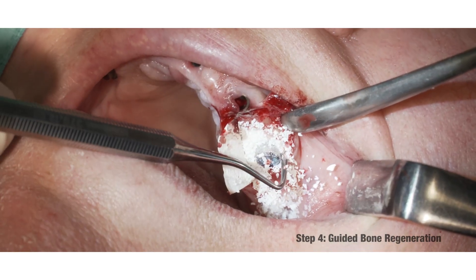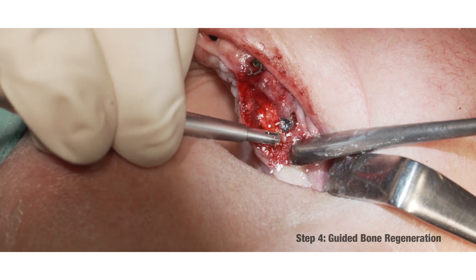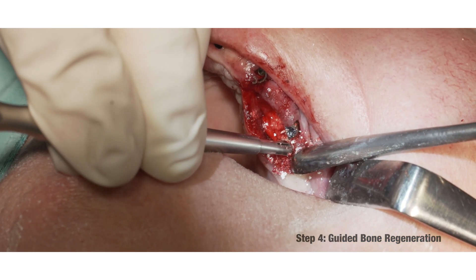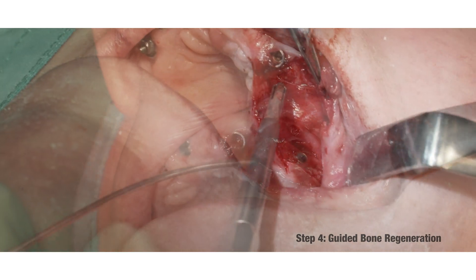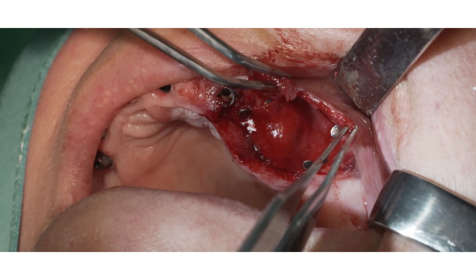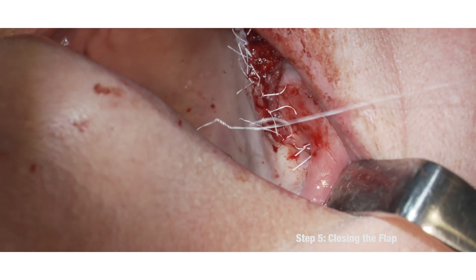Placing of a collagen membrane and filling up the bony defects surrounding the implant with bone substitute. Repositioning of the flap and suture with PTFE.